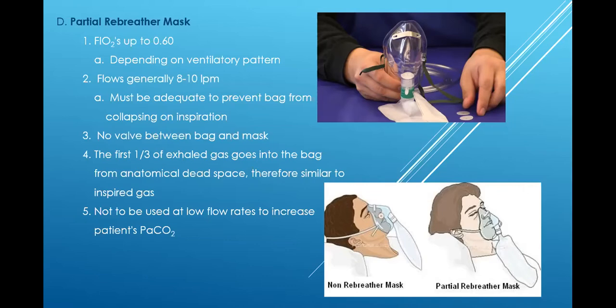Not to be used at low flow rates, because you might increase the patient's CO2. It's like, what if his CO2 is low and I want to increase it? Can I use it to do that? No, never do that. Never use a bag or a mask to try to increase somebody's CO2. You'd be suffocating them. That's just like saying, let me choke you a little bit and I get your CO2 back up, right? That'll work, but you don't want to do that.